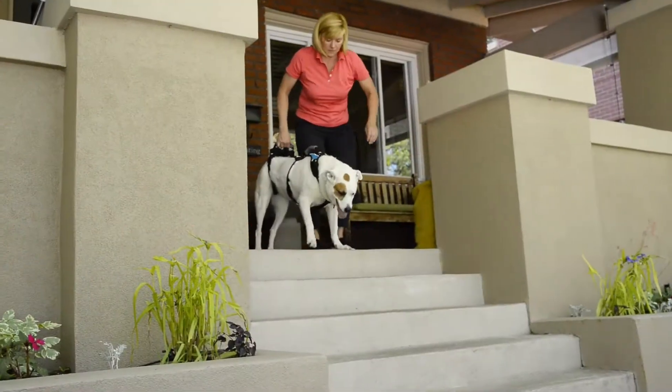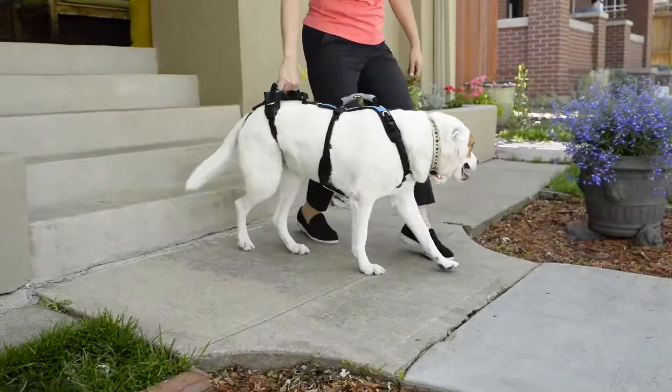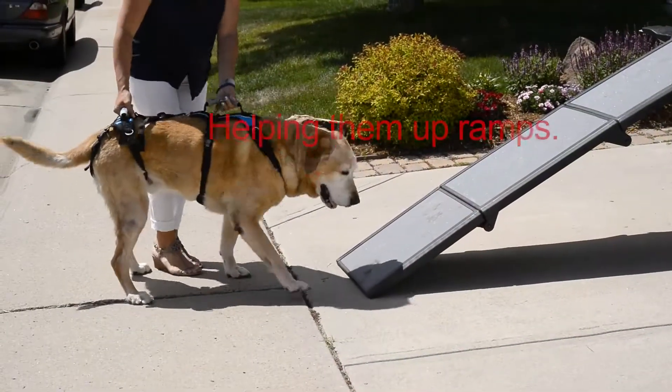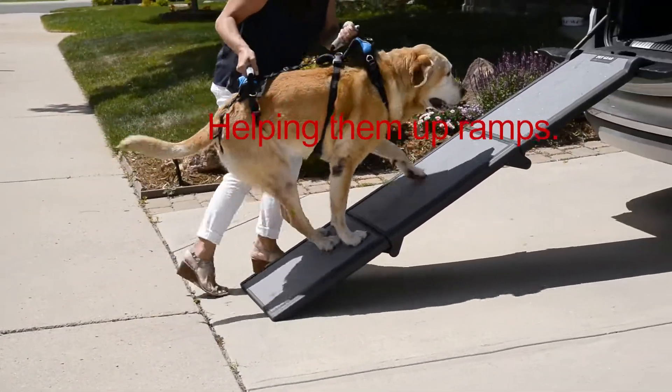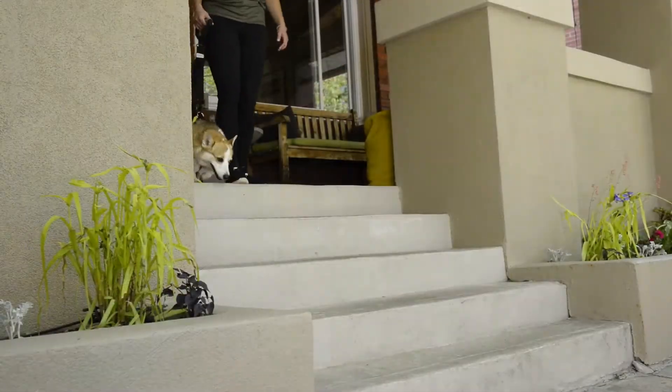A harness so unique, it's patented. With easily accessible handles above the shoulders and hips, when you lift, it lifts from under your dog's chest and pelvis so that it never pulls or strains joints or tendons.